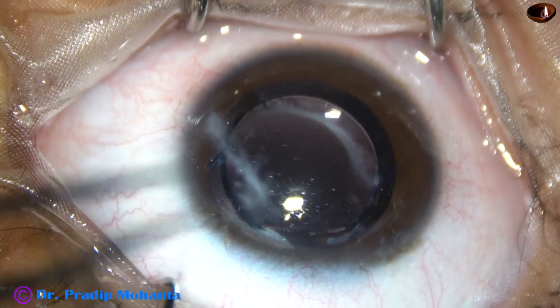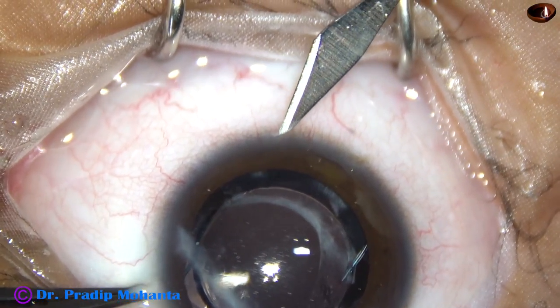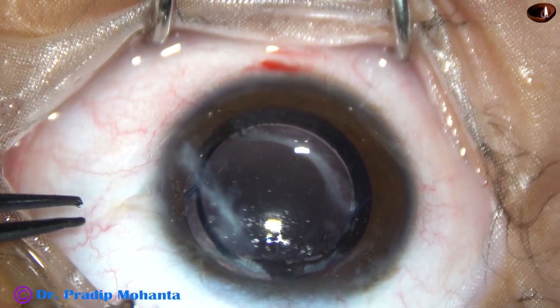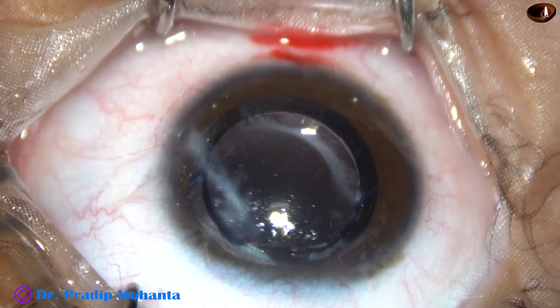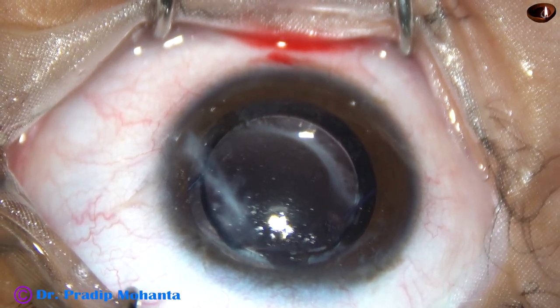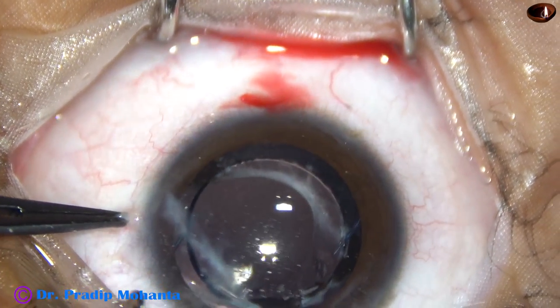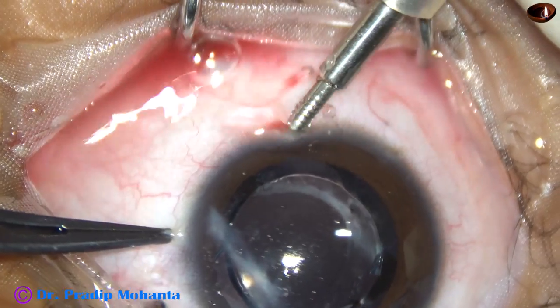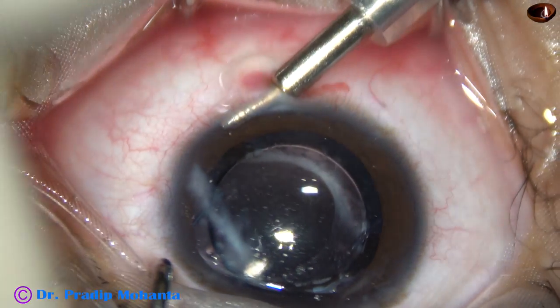This is a case of adherent leucoma. In this case, I want to cut the fibrous tissue band joining the iris and the scarred cornea. I am going to use a 23 gauge cutter. We can also use a 23 gauge vitreous scissor to cut the fibrous tissue band joining the iris and cornea. The pupil is peaked towards 3 o'clock and the pupil is disfigured, so for cosmetic reasons we are doing this surgery.